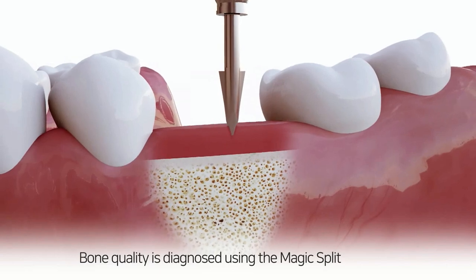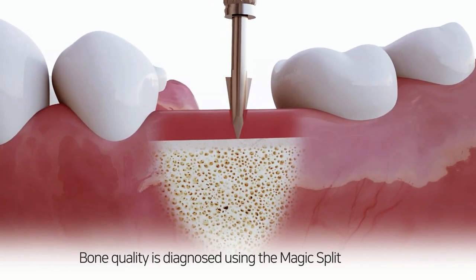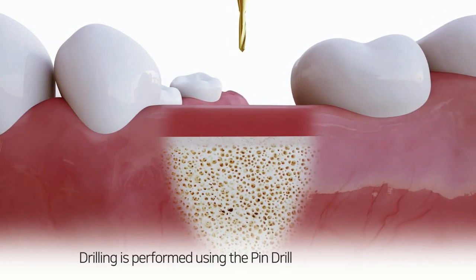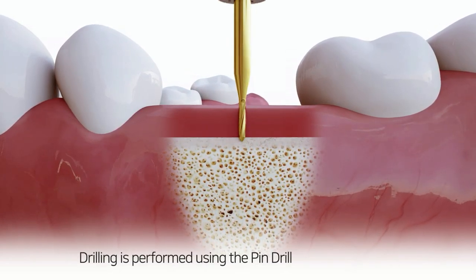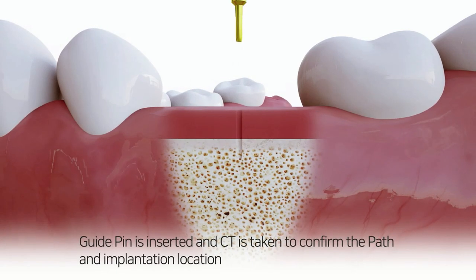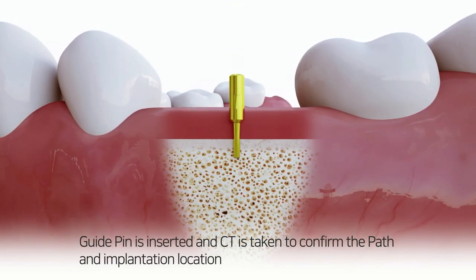Bone quality is diagnosed using the magic split. Drilling is performed using the pin drill. The guide pin is then inserted and a CT is taken to confirm the path and implantation location.